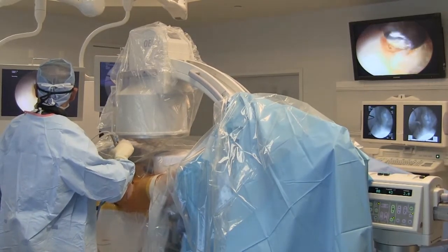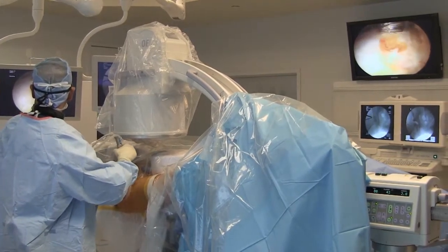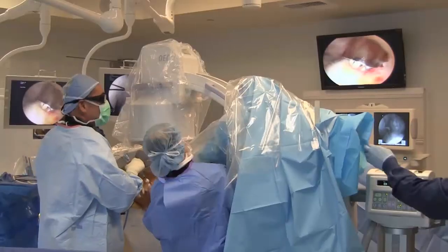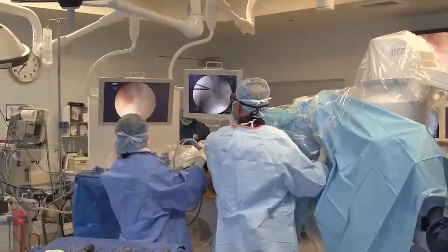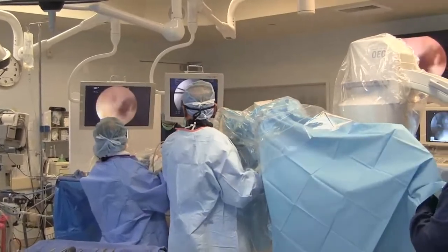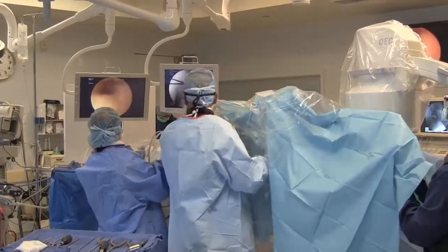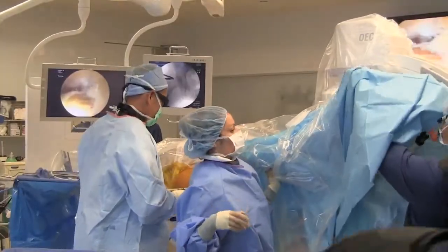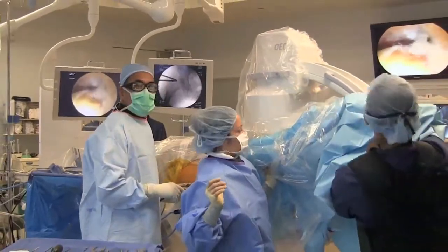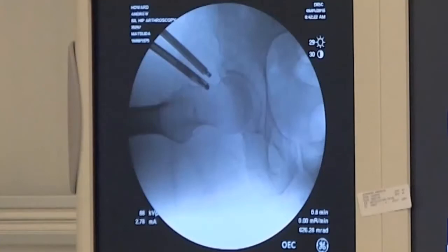Moving the hip into position so it can be viewed and treated through the small capsular window is key. The C-arm is then removed away from the operative field to allow unobstructed arthroscopic dynamic testing for confirmation of eradication of ongoing femoral acetabular impingement. The C-arm is then repositioned to obtain a modified dunlateral view to confirm radiographic anterior offset restoration.